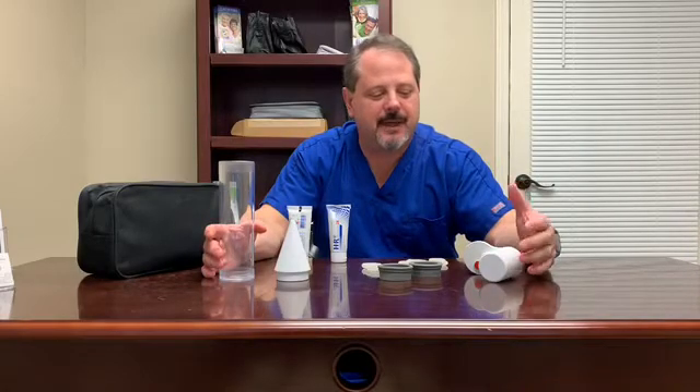Hi, this is Brent with Reach Medical. We just want to share with you the components of the MVP post-evac manual system.